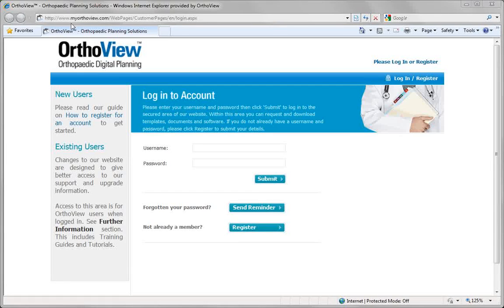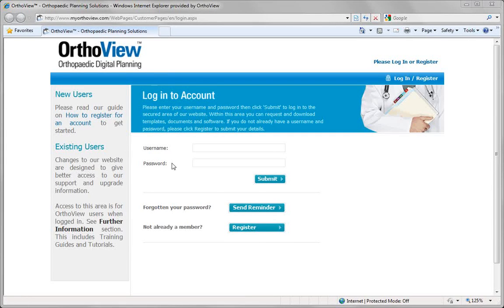To acquire templates, log in to the internet site myorthoview.com and register for an account. How to register for an account is detailed here in this document.